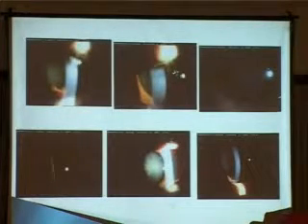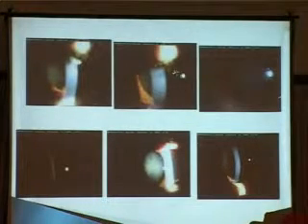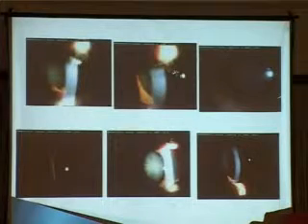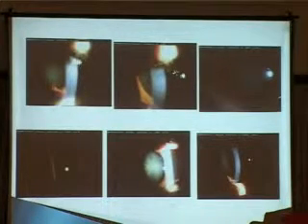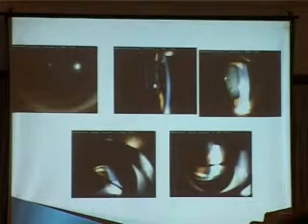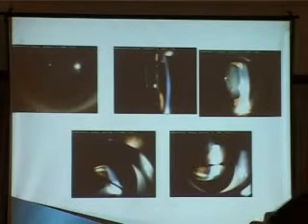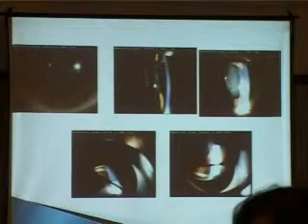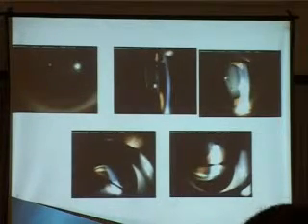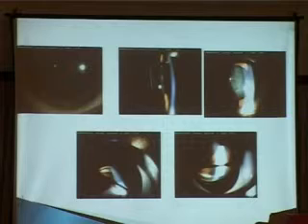This is again after 1.5 months. The patient still had a clot here. The cornea has cleared quite a lot. Here you can see the sphincter tears are still there, but the patient still had hyphema and the pressure shot up to 50. The patient was continuously monitored. You can still see the multiple areas of iris atrophy, sphincter tears, still mydriasis, this beautiful subcapsular cataract here, corneal tears.